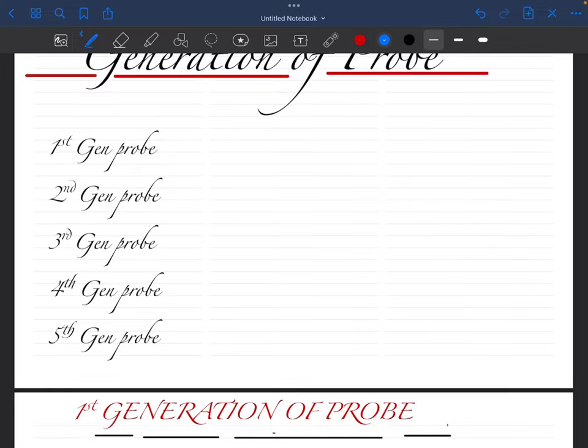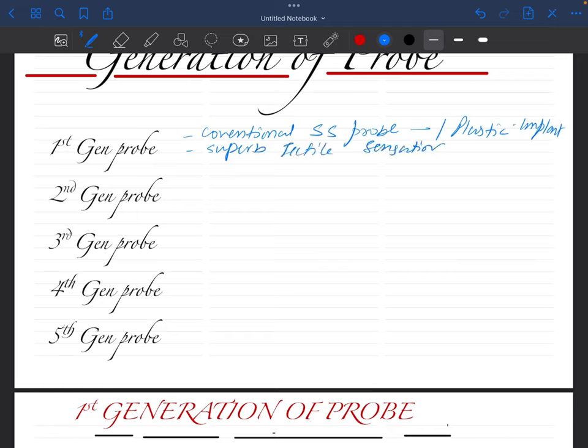Today we are going to learn about various generations of the probe. Probes are basically divided into five generations. The first generation probes are our conventional stainless steel probes which we use in our clinics. They are sometimes made up of plastics for implants. They have superb tactile sensation, but because of no limitation, there are uncontrolled forces applied on the gingiva, which ends up giving us errors in recording.